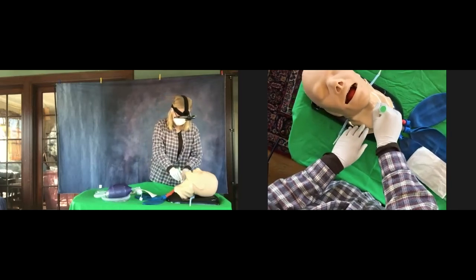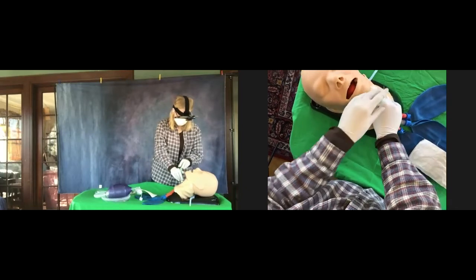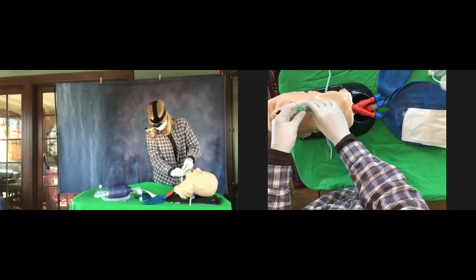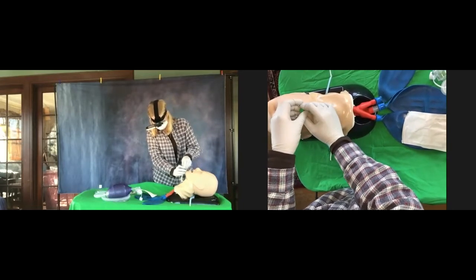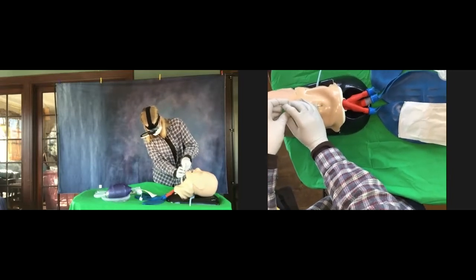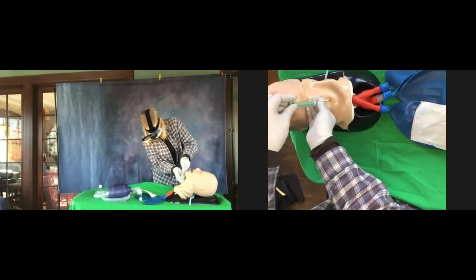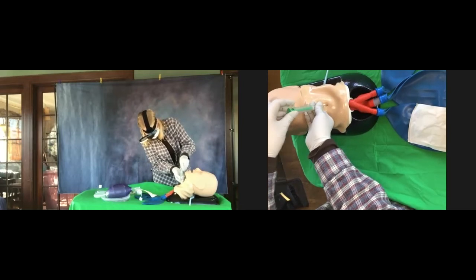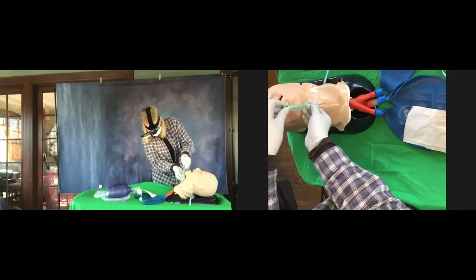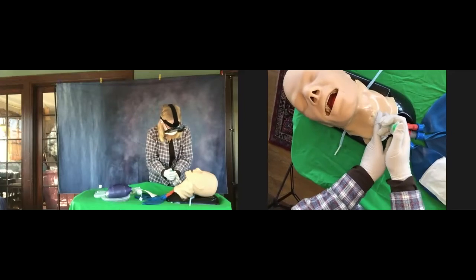Good. Now you're going to slowly advance it until the stopper hits the skin. At the same time, aspirate. Use your right hand to push the whole thing in through the skin until the stopper reaches the skin. Tell me when the stopper is on the skin. Tilt it straight up and down a little bit more — push it through so it's in the skin.